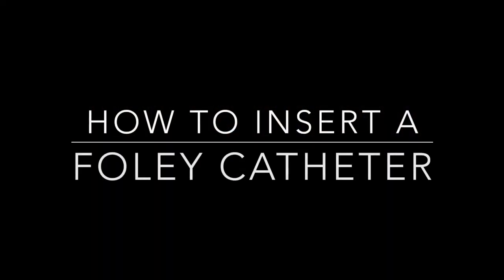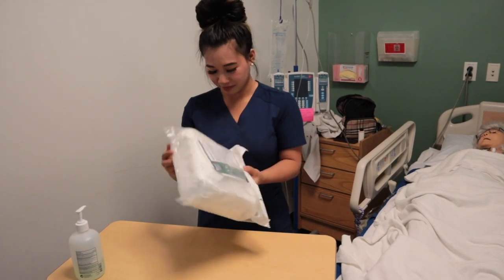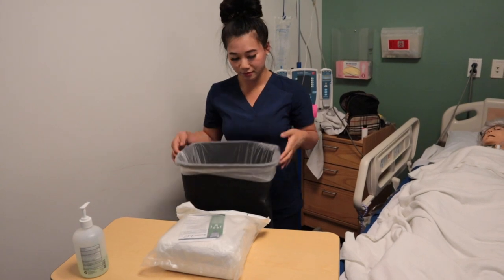Let's get started. How to insert a Foley catheter, aka an indwelling urinary catheter. So this is what the Foley kit looks like. Before getting started, I want to make sure there is a trash can in front of me, slightly underneath the bedside table.